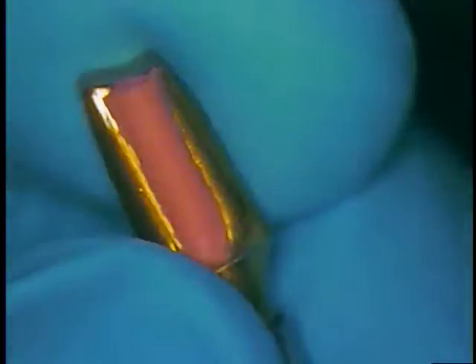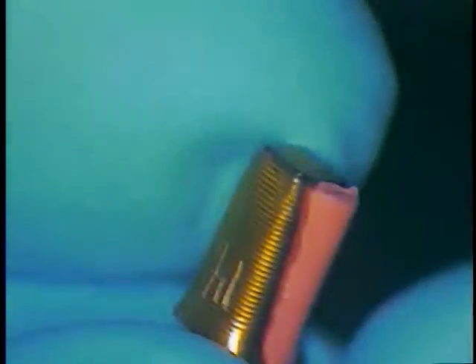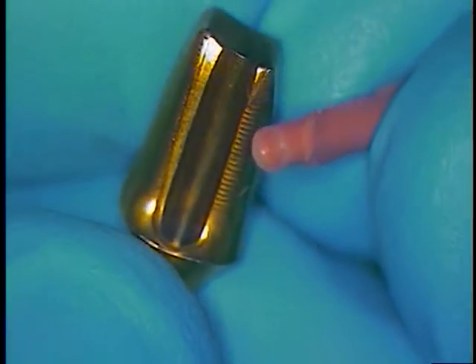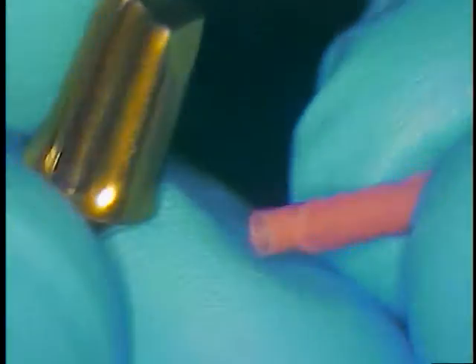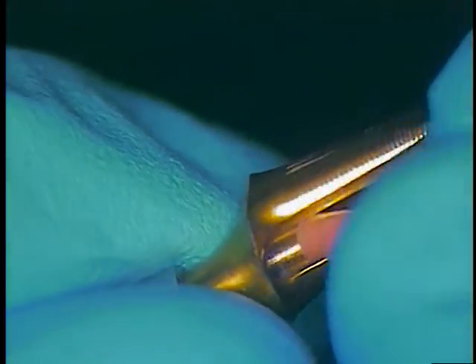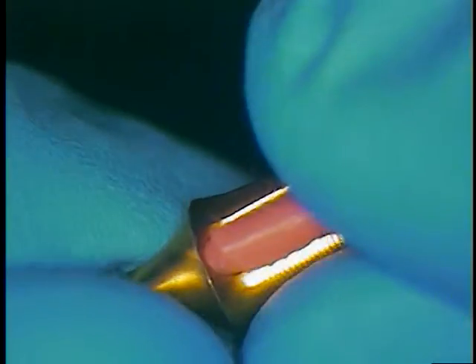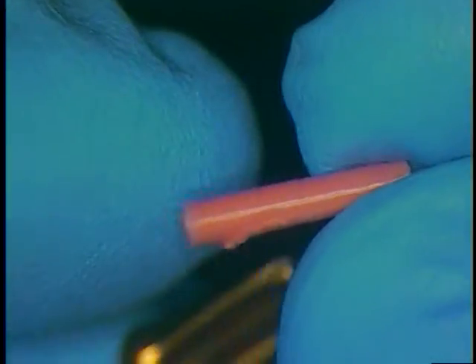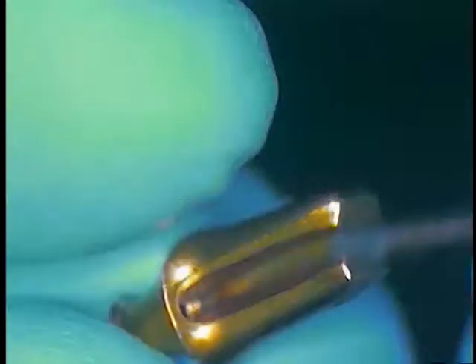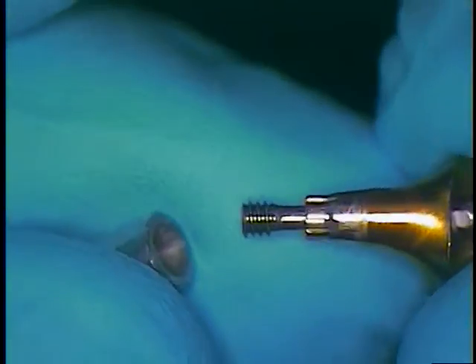Let's look at this explorer. What we're going to do is just peel this out and observe as we do it. This comes out like that, and you can see the configuration of that. That's the screw head itself, so that's going to be subject to change — we'll do a new one of these to make sure. You can see it doesn't really slide all the way back in place properly, so this will be the throwaway. Now we'll go back in the mouth.